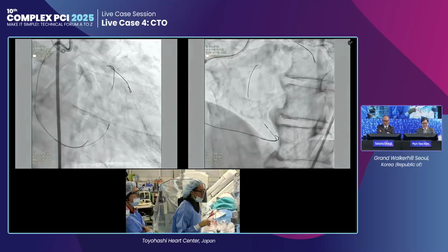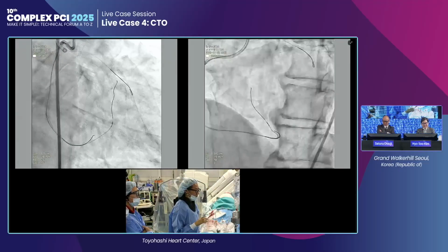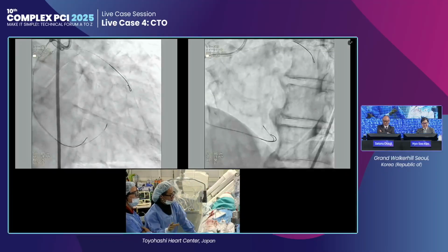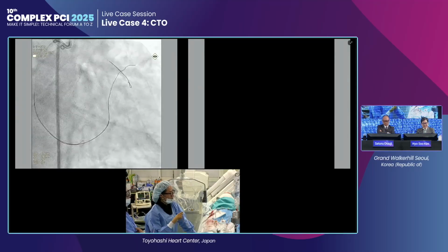And this is also channel SO3. However, this is another channel. Next. And so we finally selected XCR.